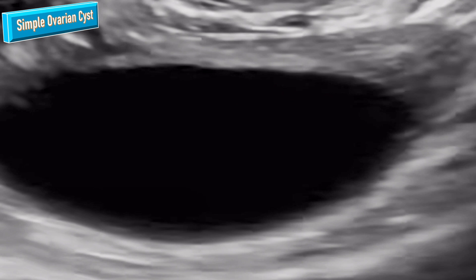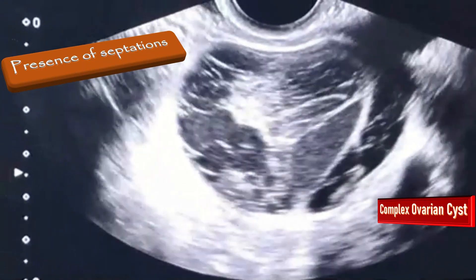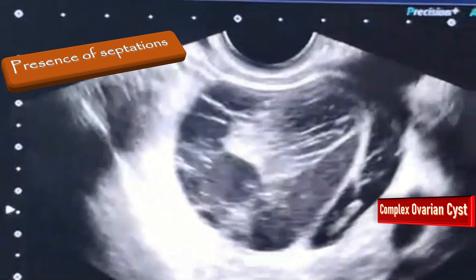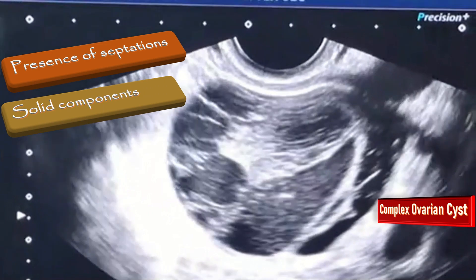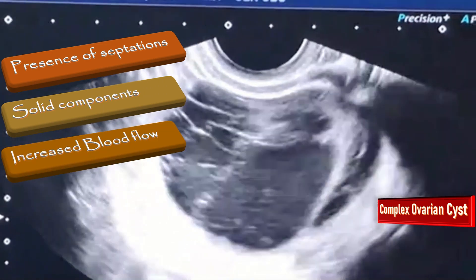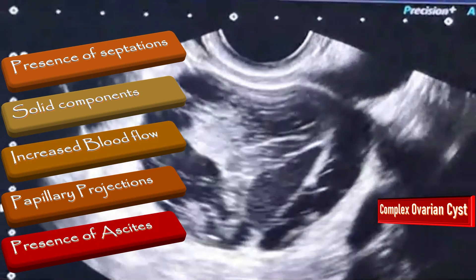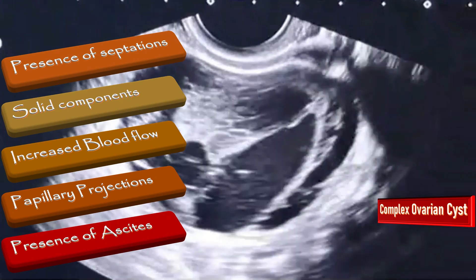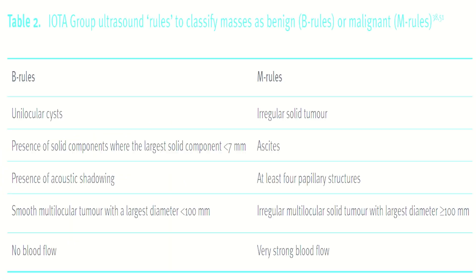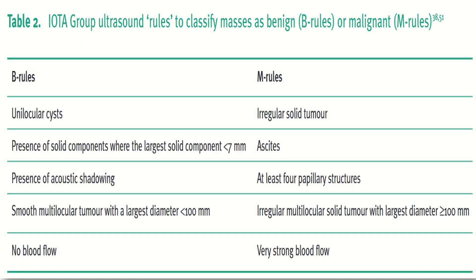The complex ovarian cyst contains certain features such as presence of septation, solid components, increased blood flow, papillary projections, and the presence of ascites.